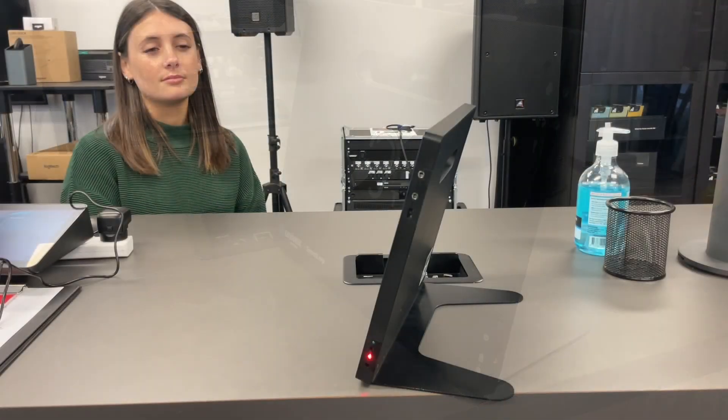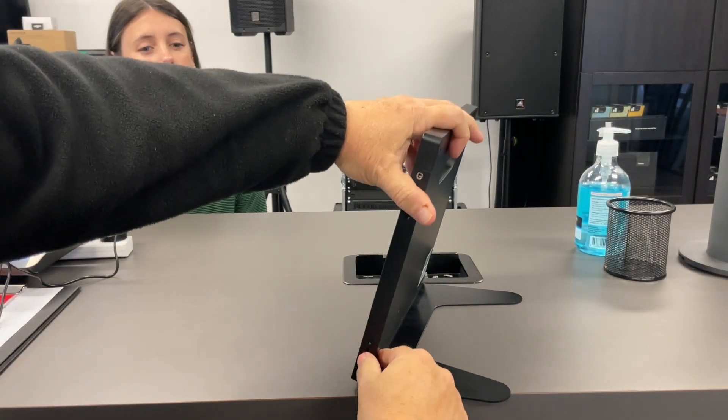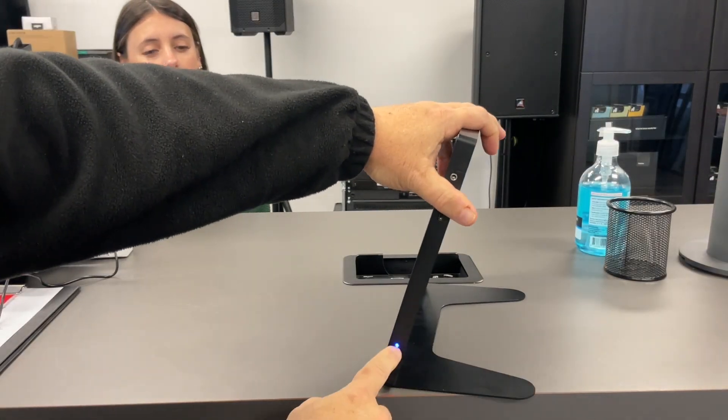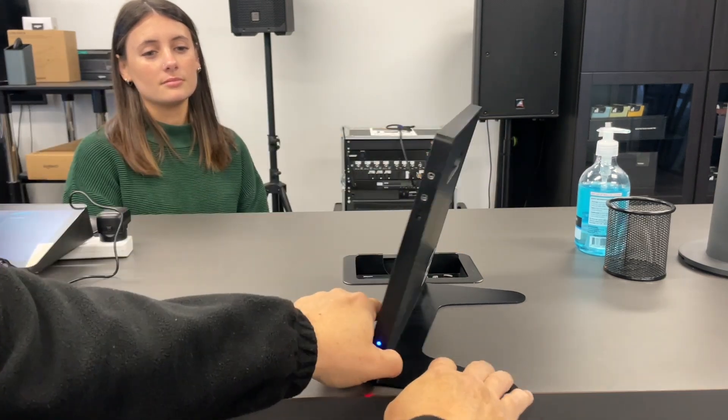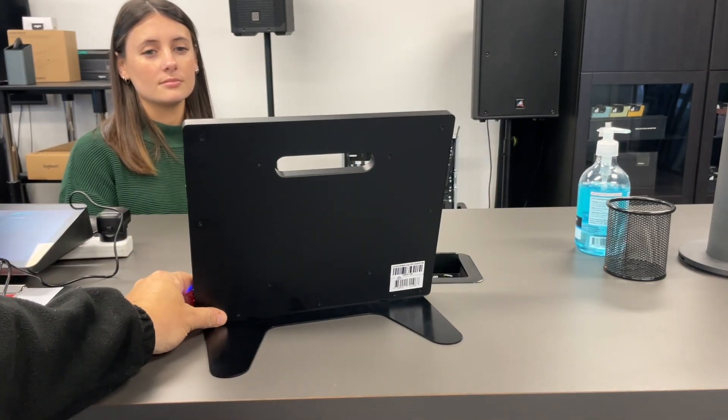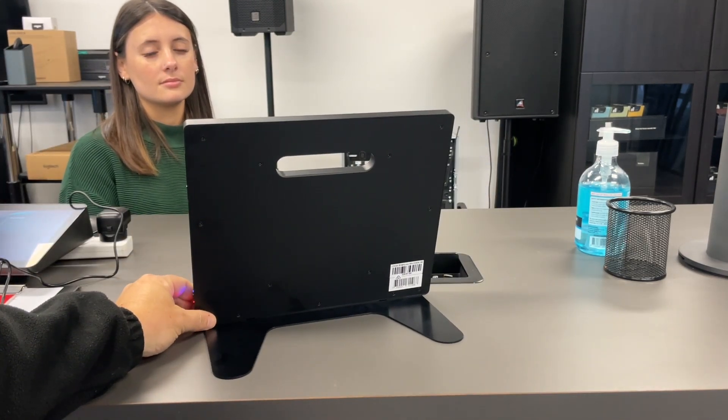Once the unit is charged, turn it on and you'll see the blue light come on. Place it on the counter facing towards your client.